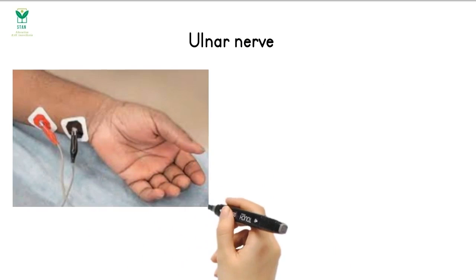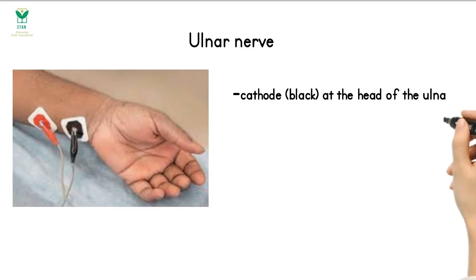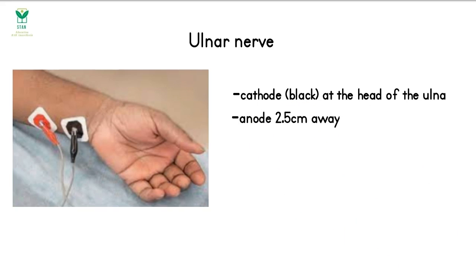For monitoring the neuromuscular junction at the ulnar nerve, first place the cathode, which is the black electrode, distally at the head of the ulna. The nerve is superficial here. Second, place the anode 2.5 centimeters away, proximally, and preferably not in the path of the ulnar nerve.